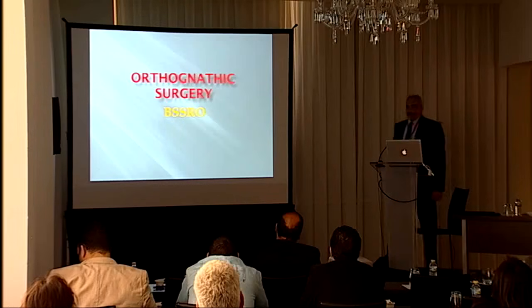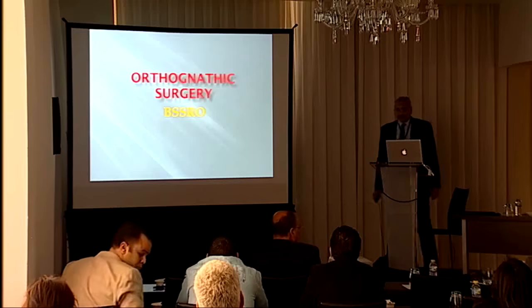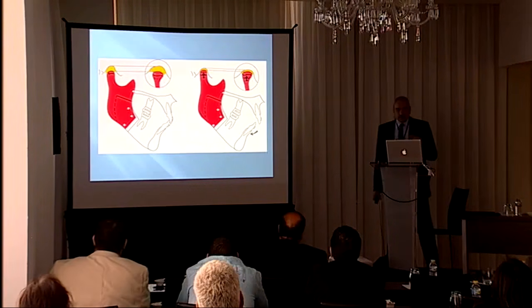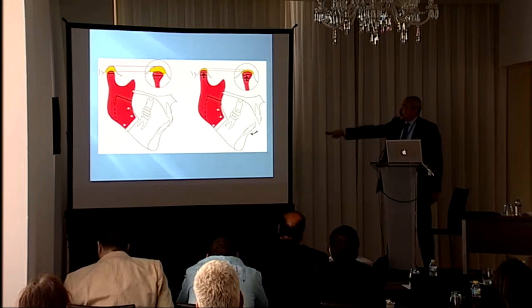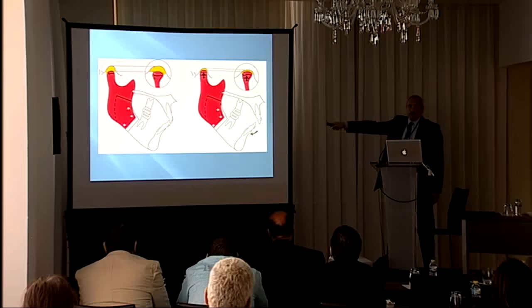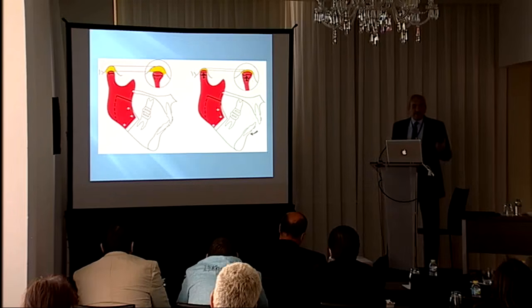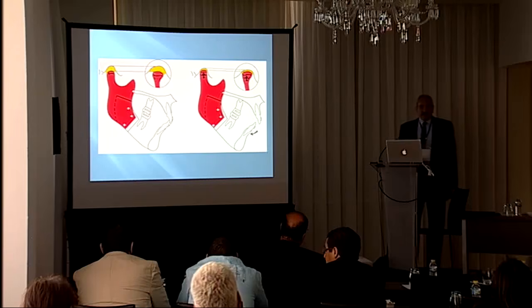So in another use for orthognathic surgery, we start with the bilateral sagittal split osteotomy. What was the problem, or what we thought was the problem, is sometimes when you do the sagittal split, you align the condyle into place manually. And after you fix that, if the condyle was not seated well, then it seats after the patient awakes and the effect of the muscle relaxant goes away. Those muscles pull the condyle in place, and you end up with an immediate open bite.